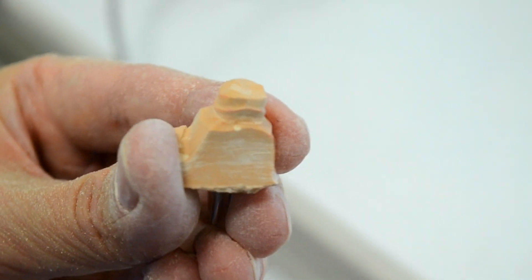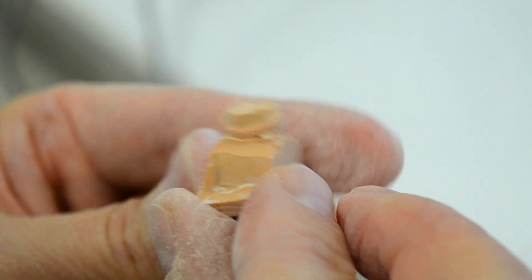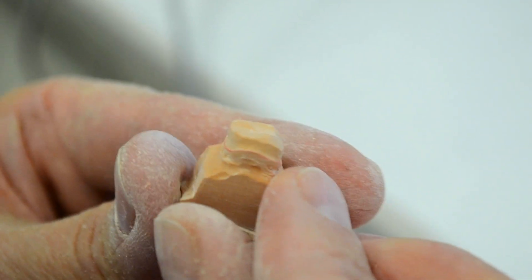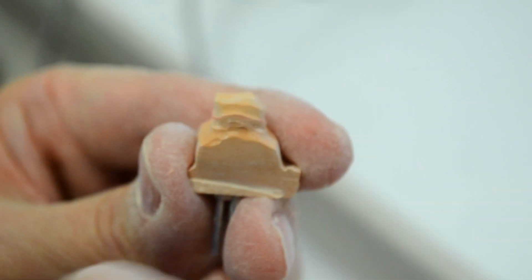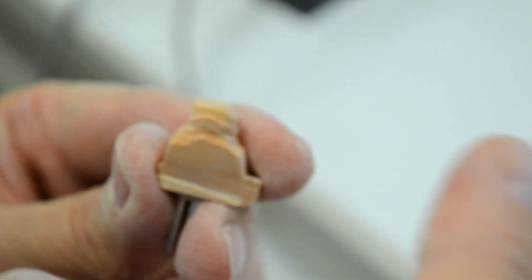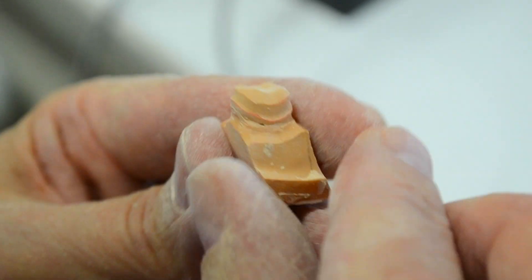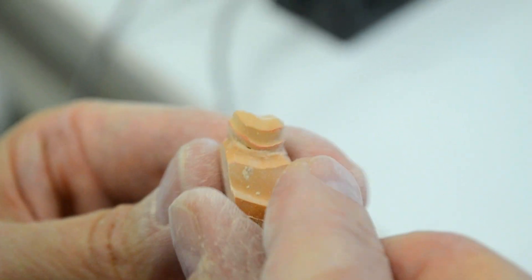And there you have it. This is a perfectly marked die. The reason that red is used is it's a color that contrasts nicely with the blue color of inlay wax, so there's no mistaking about where the margin is.